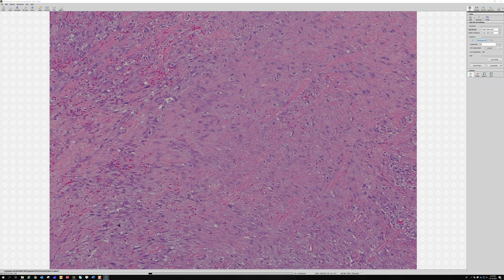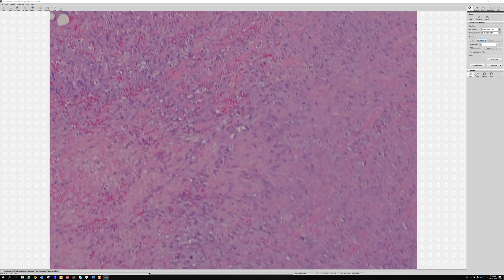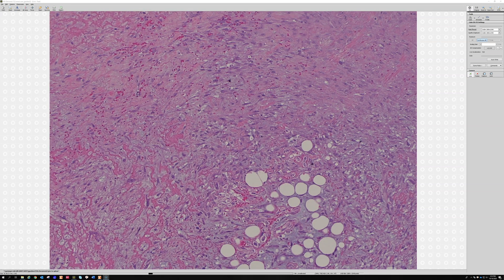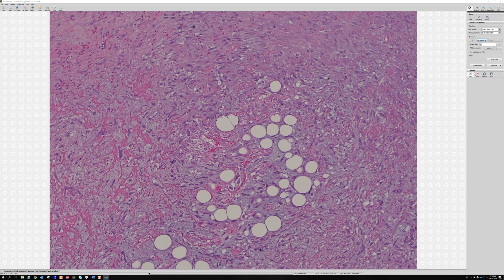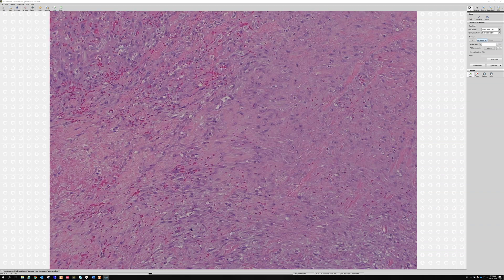The appearance is very much like what you'd see in a tumor with fat — like a liposarcoma, well-differentiated liposarcoma with myxoid change, or atypical lipomatous tumor. You could also think of a myxoid-looking DFSP at low power, although the cells here are much bigger and more plump. DFSP uses very thin stretched-out, neural-looking cells — not these big plump myofibroblasts — so that distinction helps.